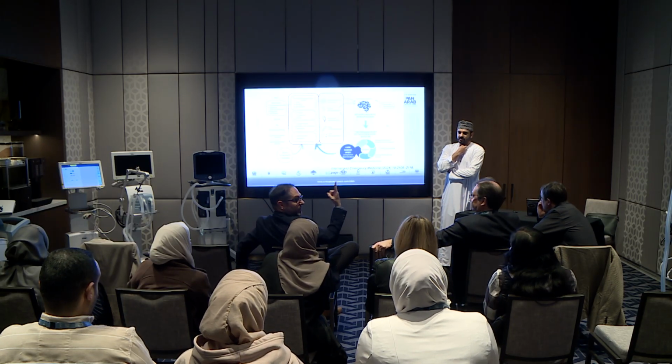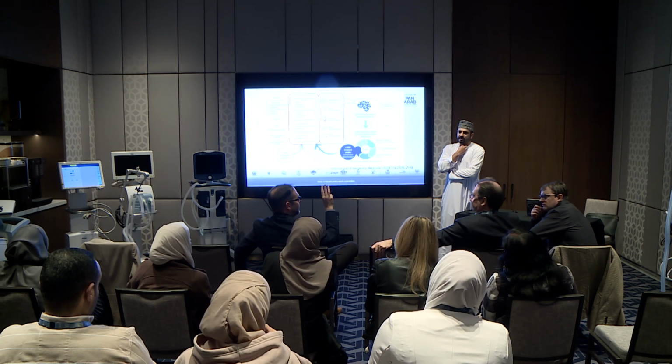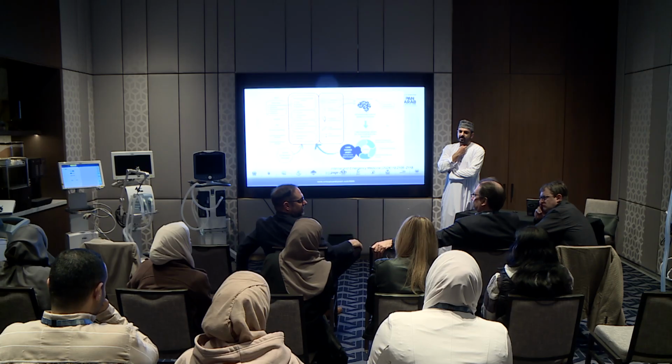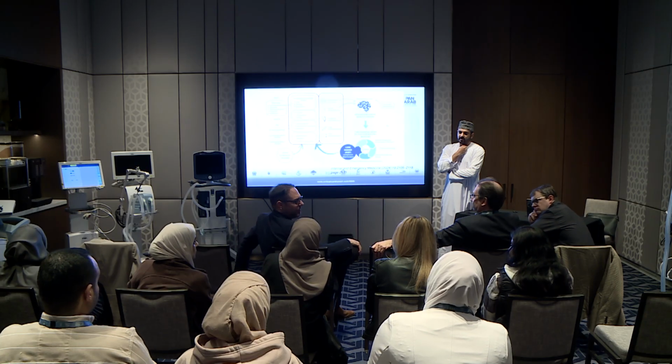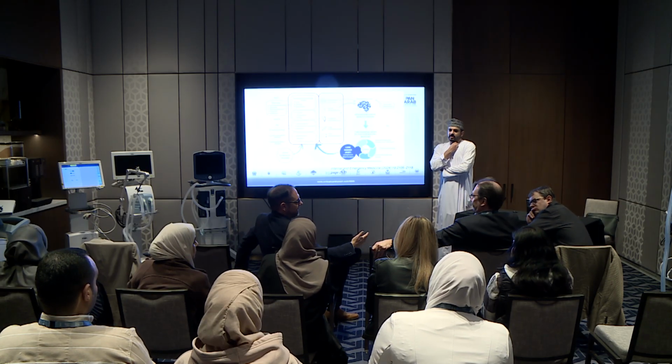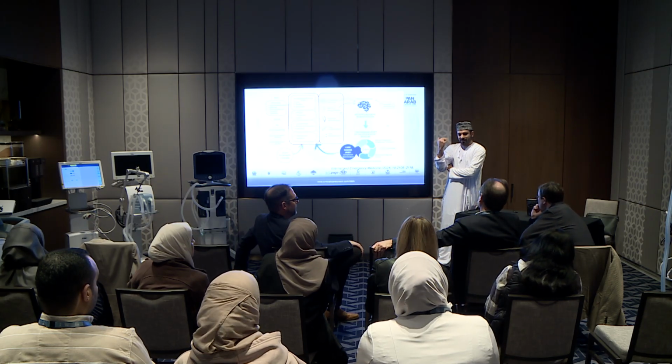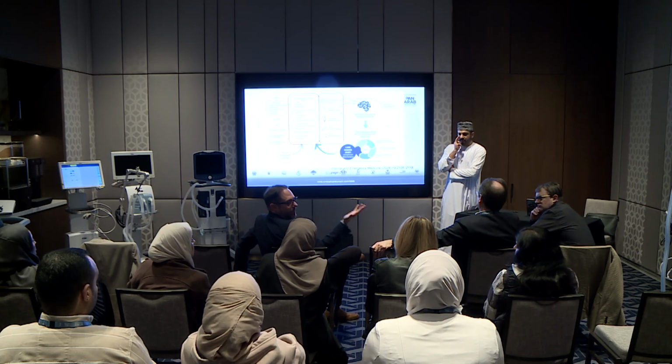It's usually a single breath occlusion, one breath, but you're right, you do three of them, separated apart, give the patient some time to recover. How far apart is really up to you, I think, maybe five breaths. You can do them within the same setting. You don't have to go up and come back, just wait.